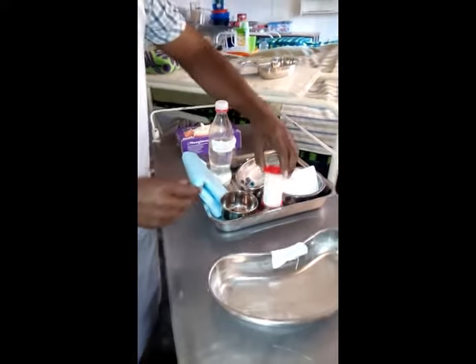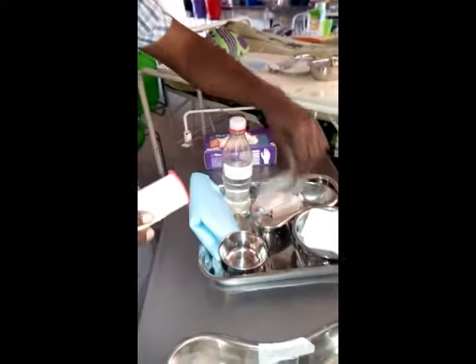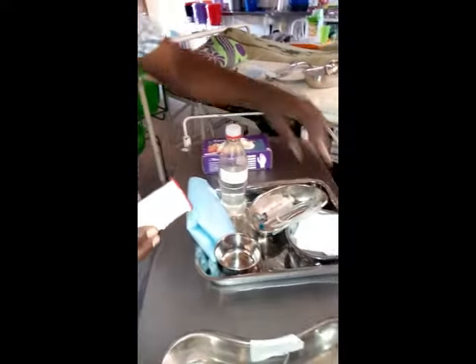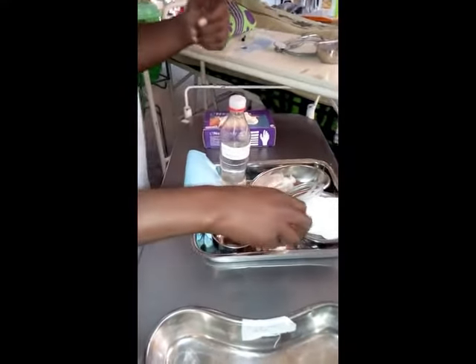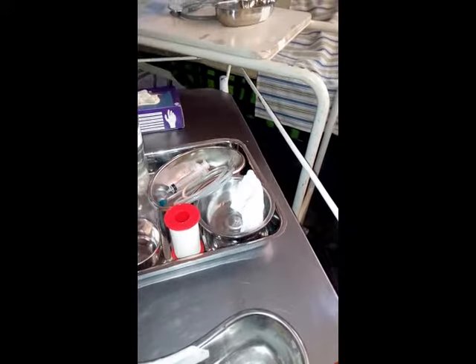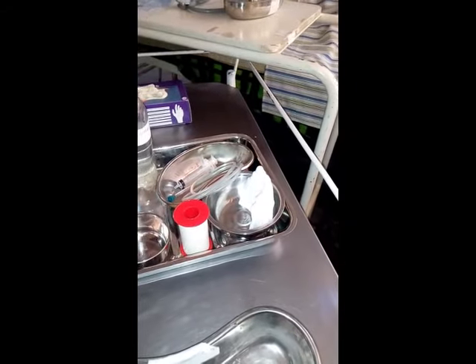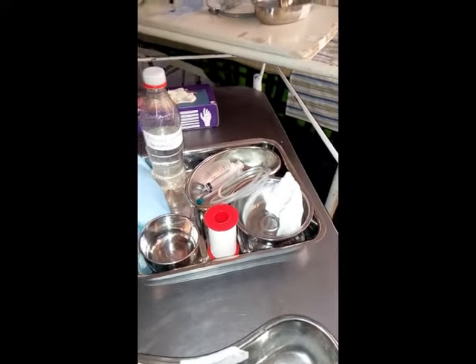Then we've got strapping. Strapping will be used for marking the nasogastric tube, as well as for securing the tube on the cheek. Then we've got swabs here. These swabs are for cleaning the patient as they blow their nose, as well as for any other use in case any other need arises.